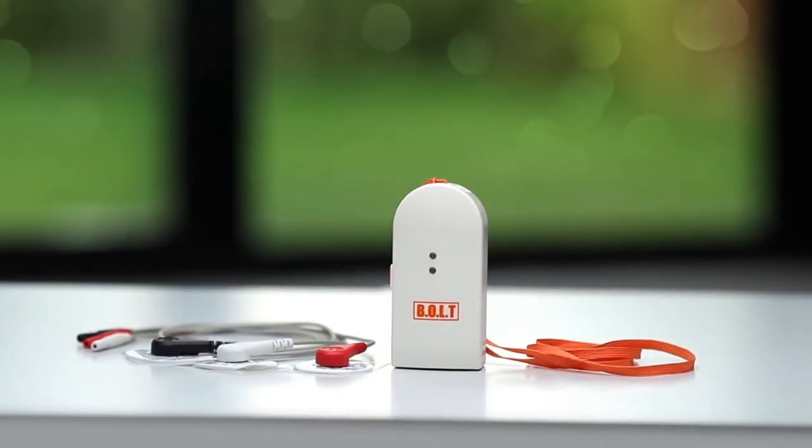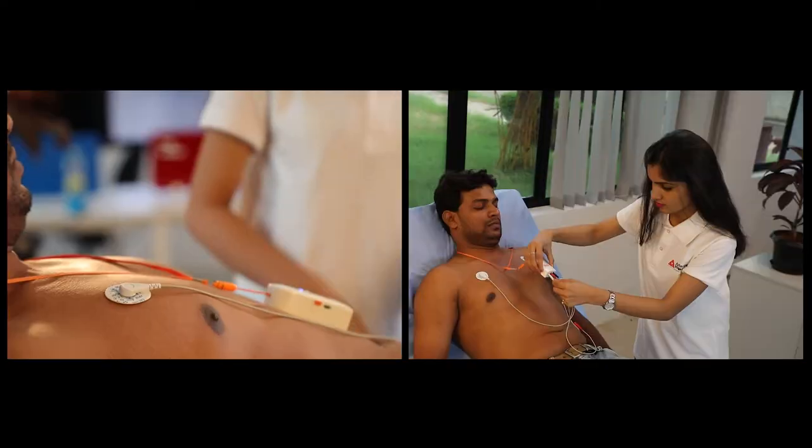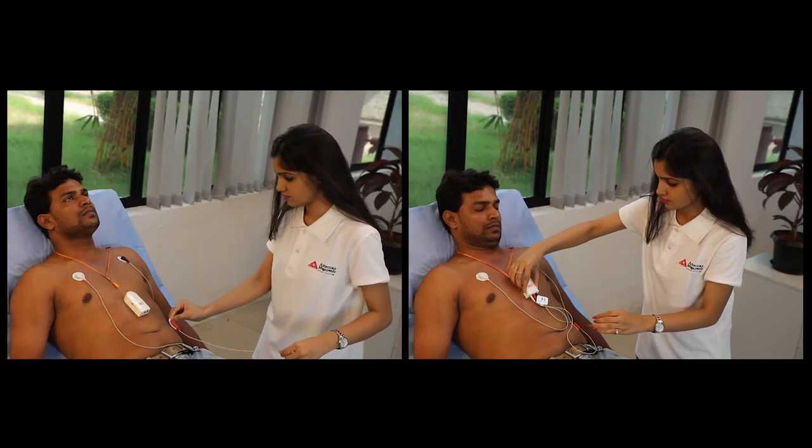The wireless Bolt ECG device is compact and portable and monitors your heart condition. To check ECG, connect the ECG electrode cables to the connector of the device.